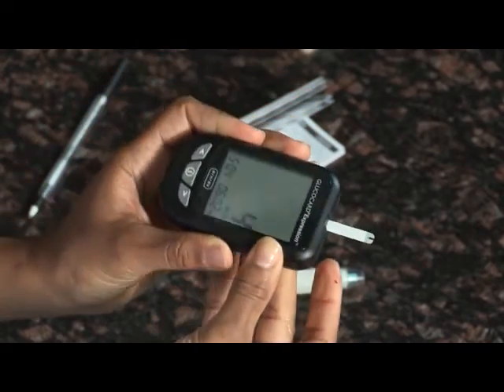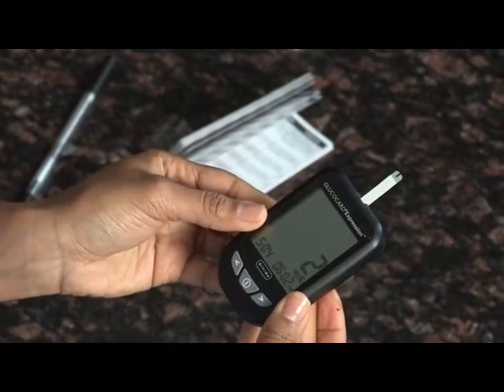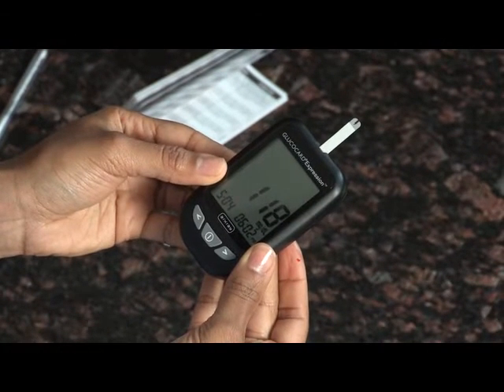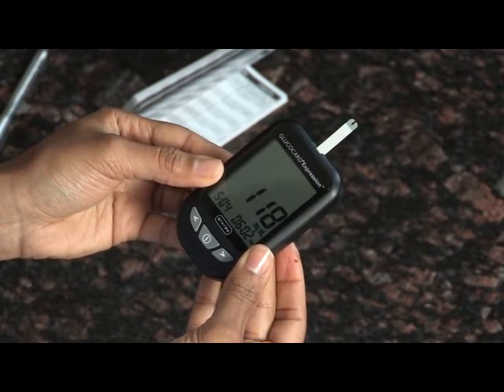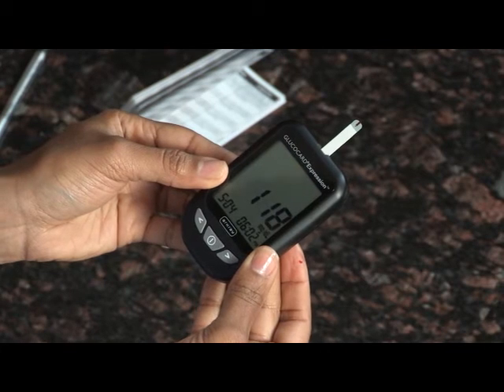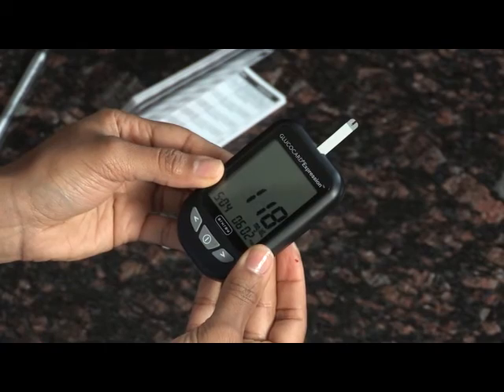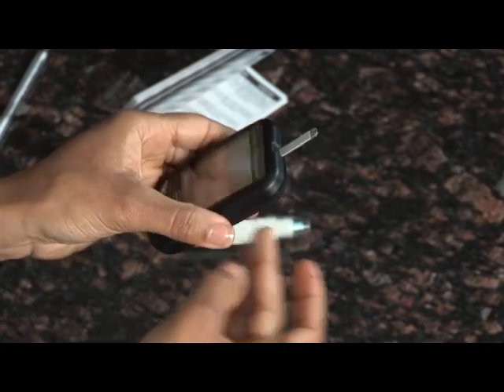The screen will start to count down. After 6 seconds, your glucose test result will appear on the meter display screen and announced verbally if you have the voice feature turned on. Your test result will be automatically stored into the meter memory. Remove the used test strip and discard in the proper waste container. The meter will automatically shut off.